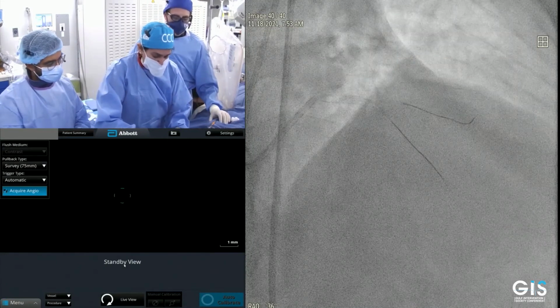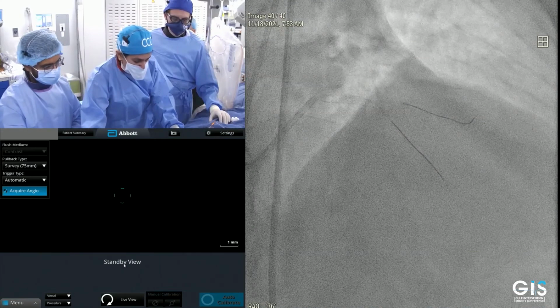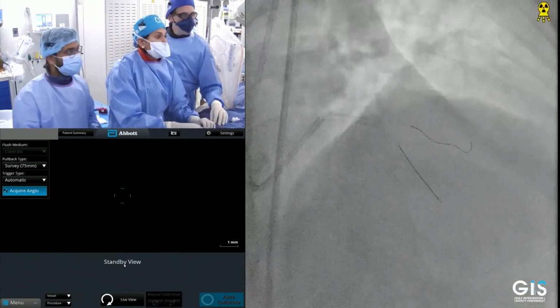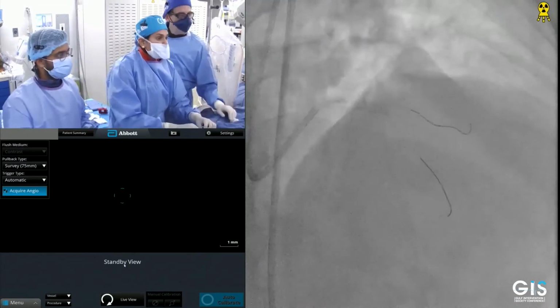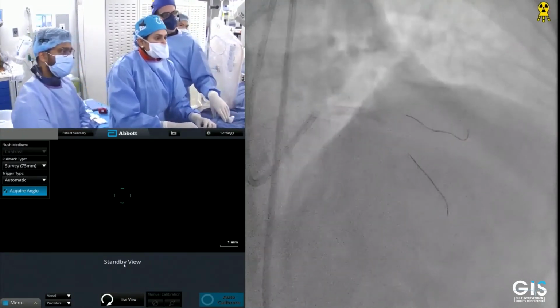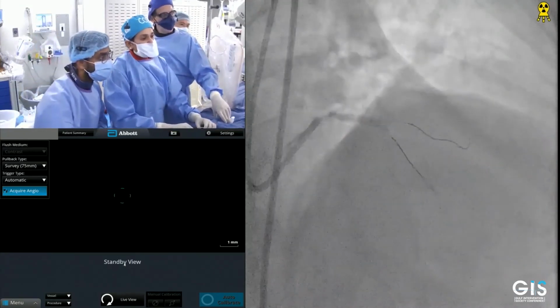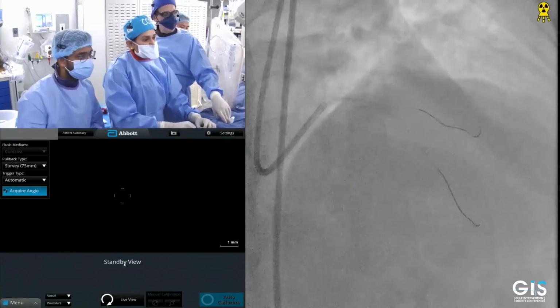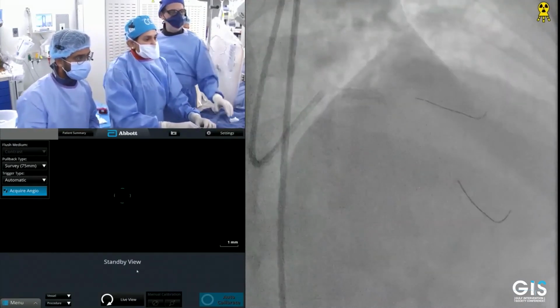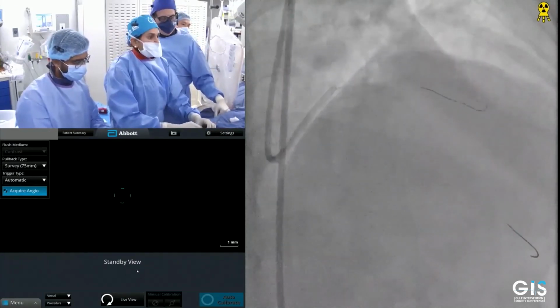Do you necessarily need POT now? I mean, you can do imaging without POT. Why do you need a POT now? Or are you going to the OCT to show the uniformity of the stent, whether there's a need for POT or not? Angiographically, we already look a little bit oversized. So I think it's very meaningful to do the imaging because, as you say, maybe a POT is a good idea, but it's not 100% because this stent already looks a bit oversized. So let's see how it looks intraluminally, though.